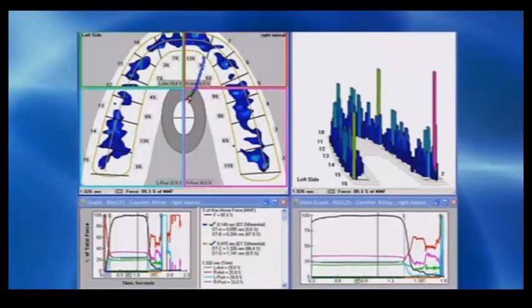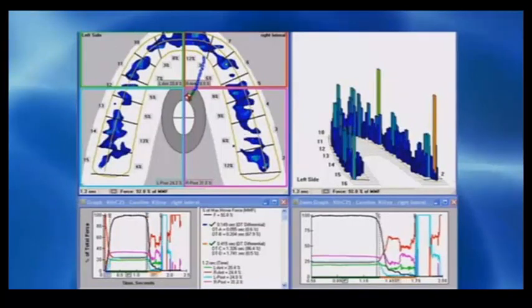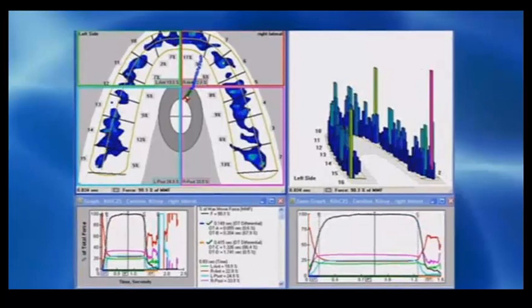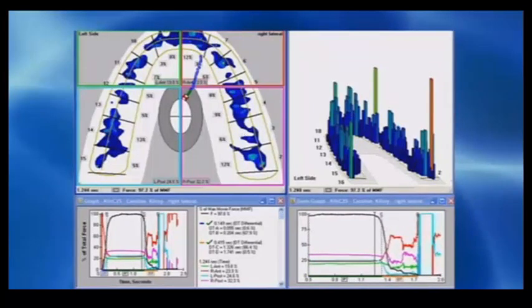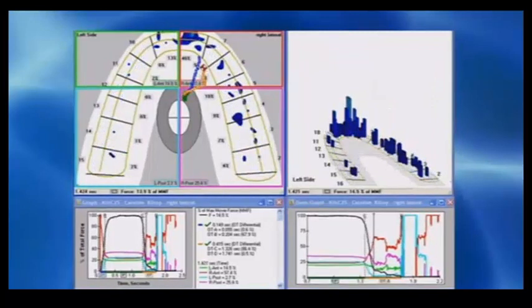And then in one of the movements, to the right, I believe, we have a little bit too much tooth contact when you move to the right on the left side, which has been a battle with you to try to get those last few teeth to separate. So there's a little bit of drag in the posterior right and the posterior left, but not too bad.